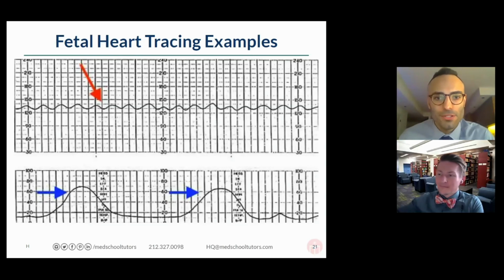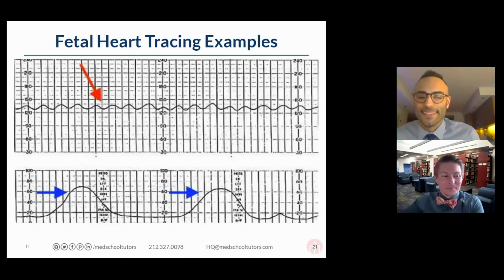Okay, I'm seeing anemia. Anemia, question mark. We'll talk about it in a second. Anybody else? So sinusoidal heart tracings are concerning for blood loss anemia. That's correct. And in the context of the mother with respect to the vignette, if she's abnormally tachycardic, she could be a sign of hypovolemic shock and blood loss occurring from somewhere.